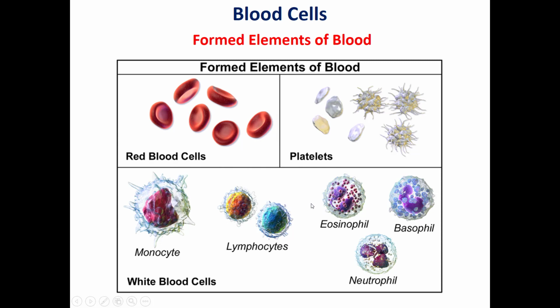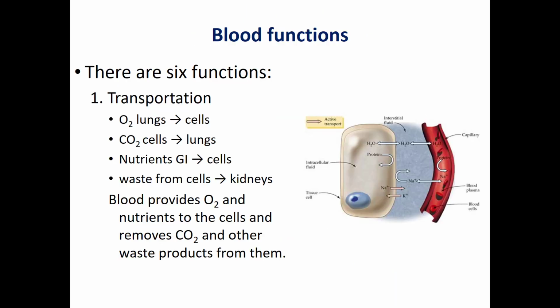So this is the main difference, and this also is important to understand the principle of the hematology analyzer, where we make the discrimination between them based on the size of each type. The largest size will be for the white blood cells, which are cells with a nucleus. The RBCs will be smaller, and the smallest will be the platelets. All the sizes of these different formed elements of the blood will be in the range of micrometers.